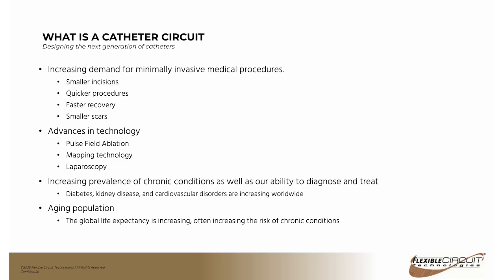Advances in technology, pulse field ablation, like I mentioned, has become more and more common. The ability to map exactly where you're at as you're looking to treat a certain segment of the heart or arteries, and then laparoscopy. I practiced that word about 10 times. I still can't get it right.